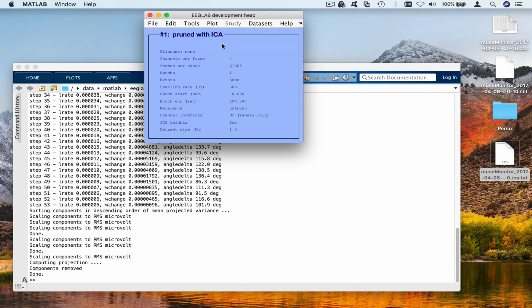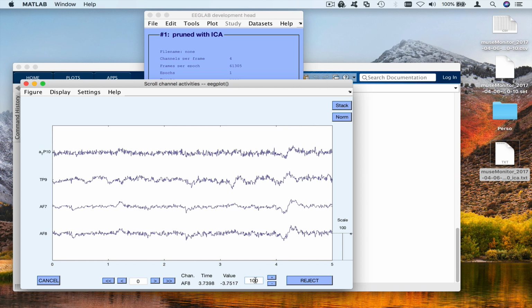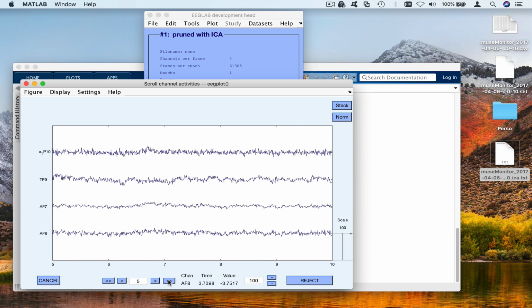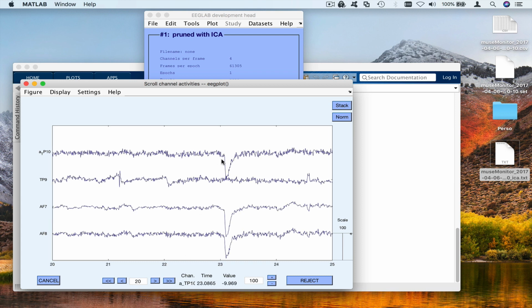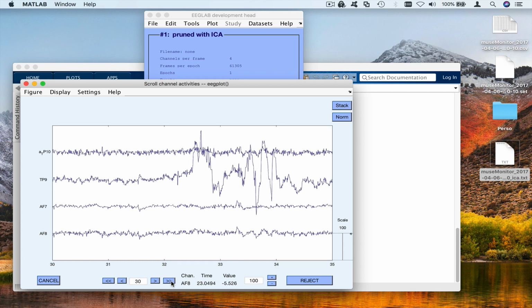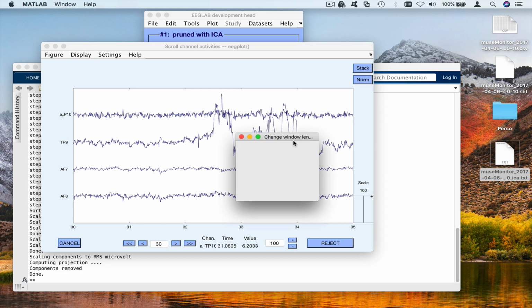Now we're going to plot the data again, change the scale. And we see it's much more acceptable right now, these two additional channels. You can still see some blanks here in all the channels, but the noise is mostly removed. So now we're going to clean that data by hand. To clean the data by hand, I like to set a large window, like 30 seconds.